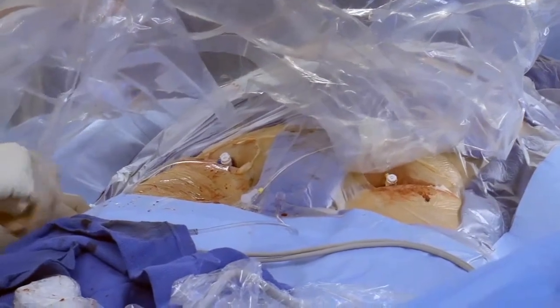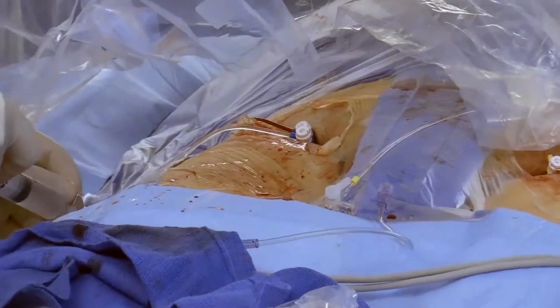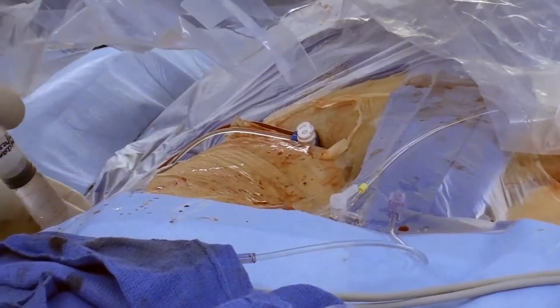Prior to Vascade MVP insertion, remember to flush the sheath with saline, then dip the device tip in saline momentarily prior to use.